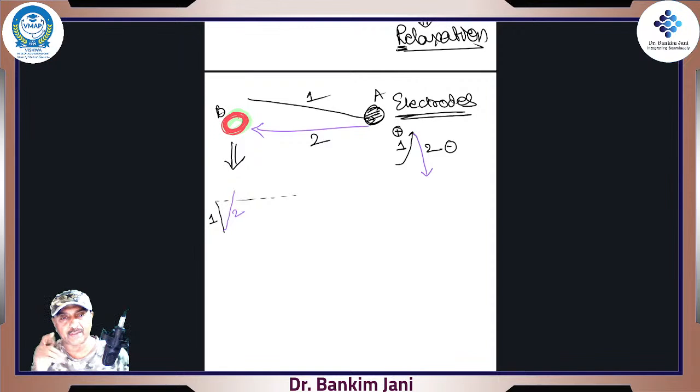It is we who have to interpret which electrode we are talking about, and we will have 12 different electrodes, right? There will be 12 electrodes. Why so many electrodes? Because we want to watch the heart from all angles, right? We want to watch the whole heart in 3D, right?